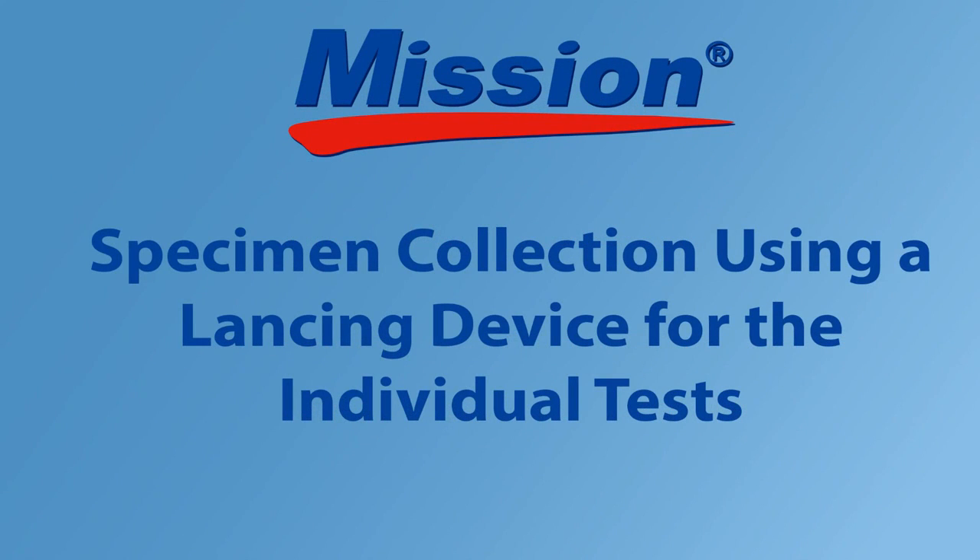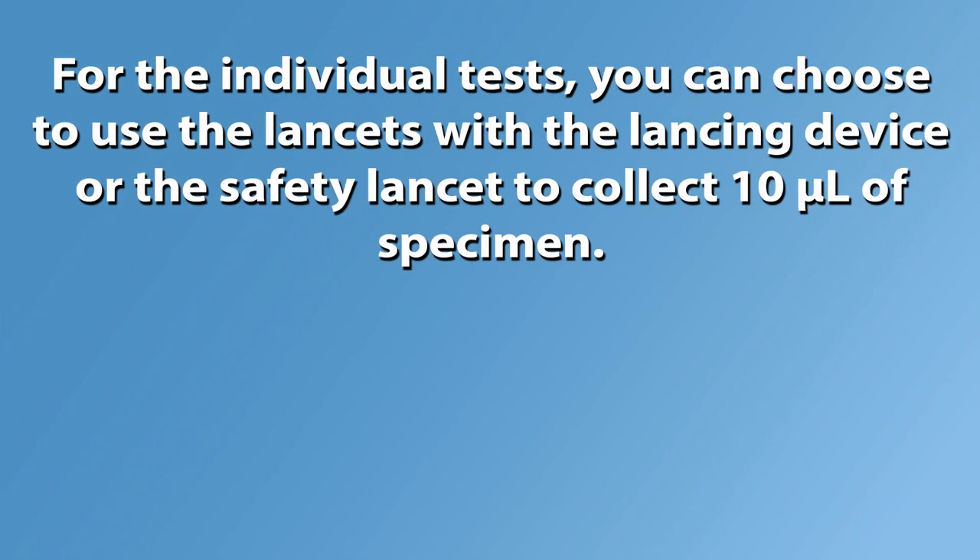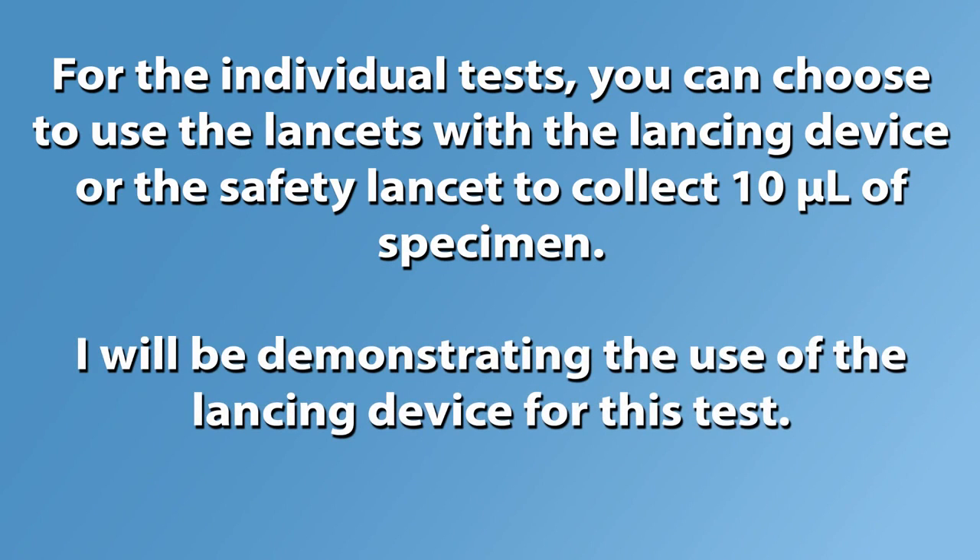Specimen collection using a lancing device for the individual tests. For the individual tests you can choose to use the lancets with the lancing device or the safety lancet to collect 10 microliters of specimen. I will be demonstrating the use of the lancing device for this test.